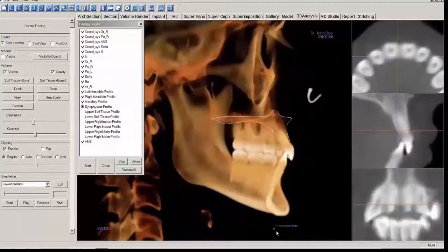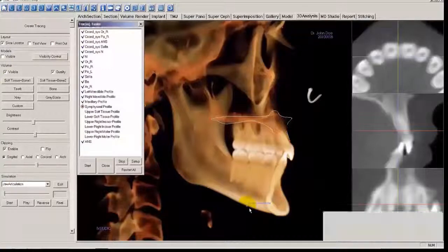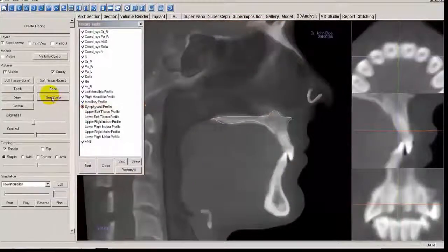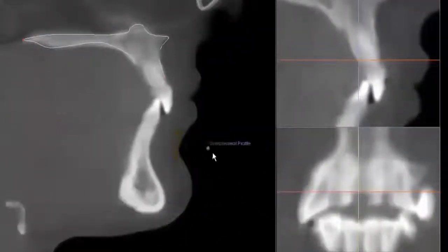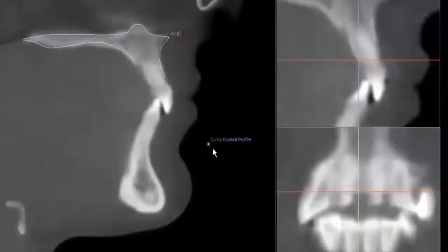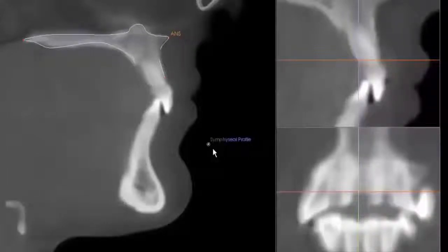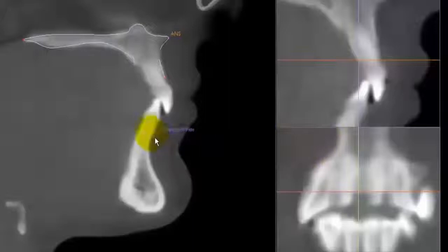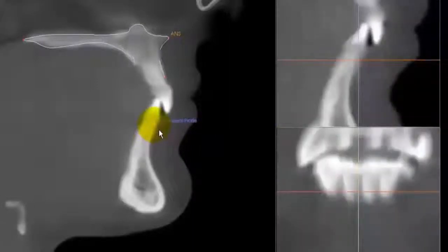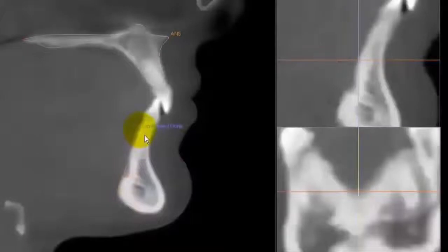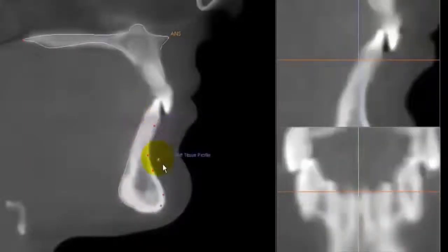Next, we'll do the Symphyseal Profile. Go back to grayscale if you like. After marking this profile, the software will automatically determine the location of the B-point, the Pogonion, the Gnathion, and the Menton. The profile will be projected onto the mid-sagittal plane. Start at the beginning of the alveolar bone on the lower central incisor, place points as you move around the bone, then right-mouse click when finished.